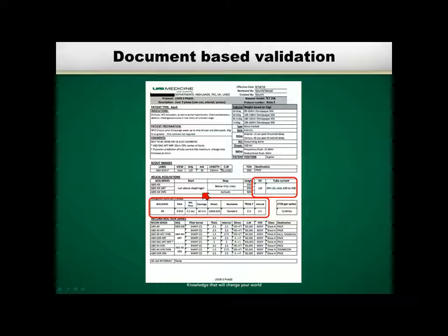We've got information that is not useful to you, but is useful to the technologist. Where does the scan start? Where does the scan end? All this acquisition information is used by you to calculate an estimate for what the CTDI for this exam should be.